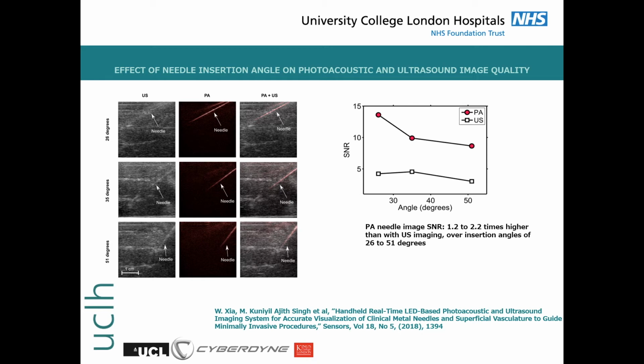Visually, you can see some difficulty in imaging the needle in the ultrasound picture, which deteriorates with increasing angles, whereas the PA overlay dramatically improves the image. It should be noted though, a 14-gauge needle is large bore when considering medical needles, and one would expect to be able to see it quite readily, even at high angles of insertion. In this experiment, photoacoustic imaging provides information complementary to the ultrasound image, while still allowing all of the ultrasound image to be seen.